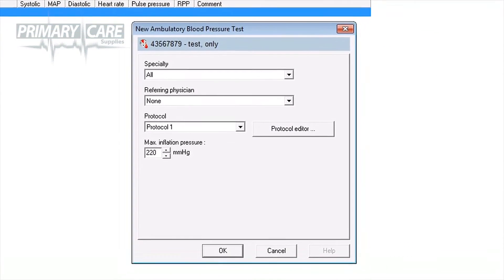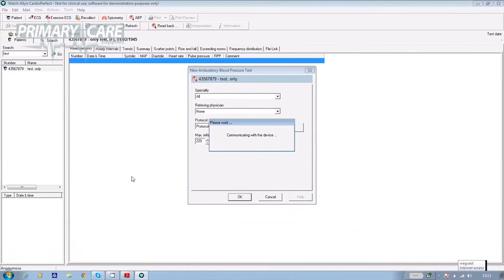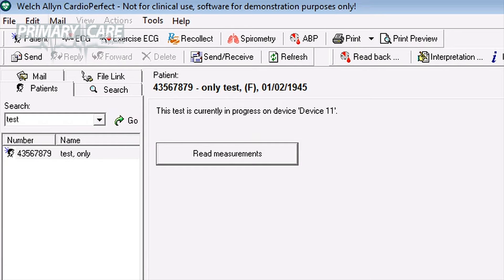The software communicates with the device and a box appears on screen saying New Ambulatory Blood Pressure Test. If the patient's details are correct, click OK and their details will be sent through the cable to the ABP unit. The screen then says the test is currently in progress on device, at which point you can disconnect the cable from the unit and bring your patient in.